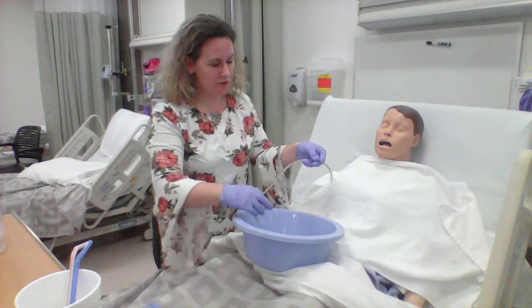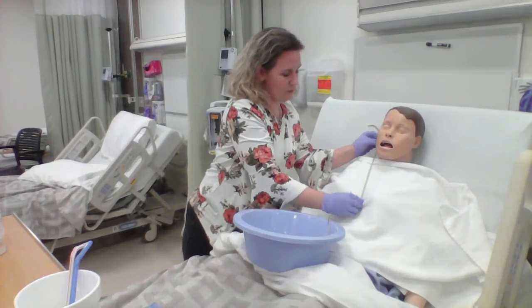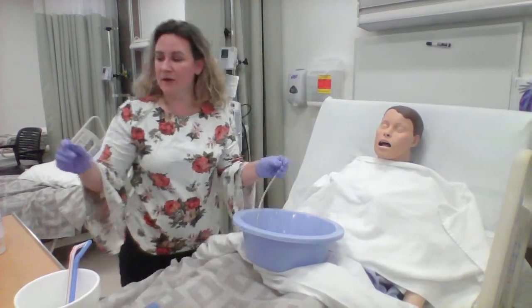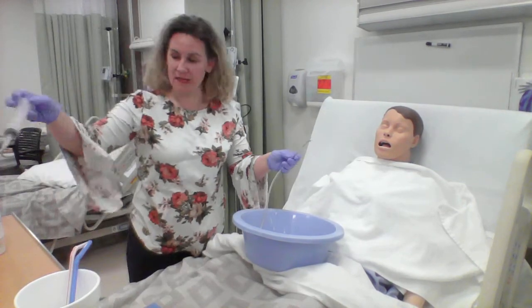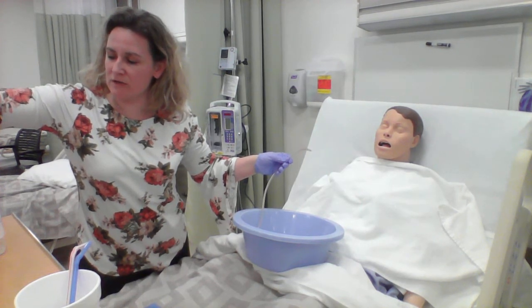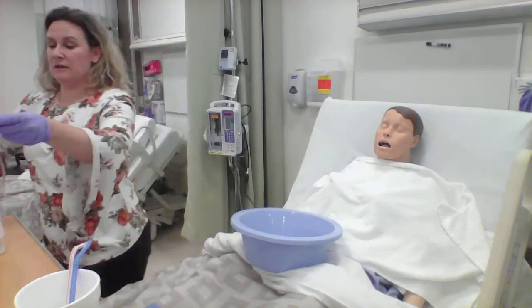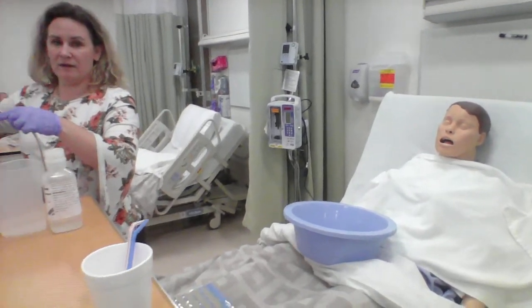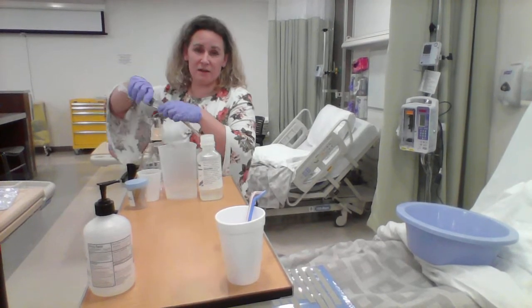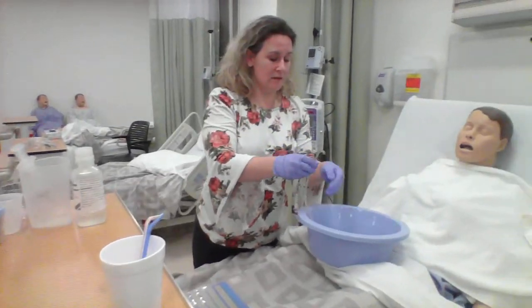We're going to go ahead and measure from the nose to the earlobe down to the xiphoid process, and then we're going to put a piece of tape on there to mark how far we're going in. We're also going to test the integrity of the tube to make sure that it is functioning properly, and we're going to do that over this. So tube is good, there's no holes or leaks or anything.